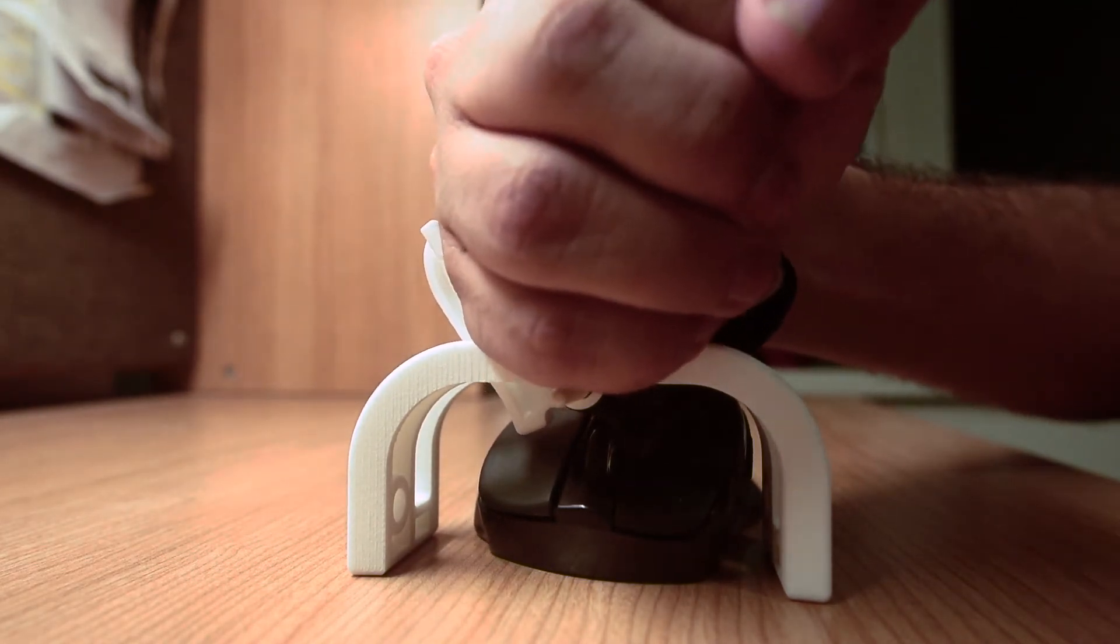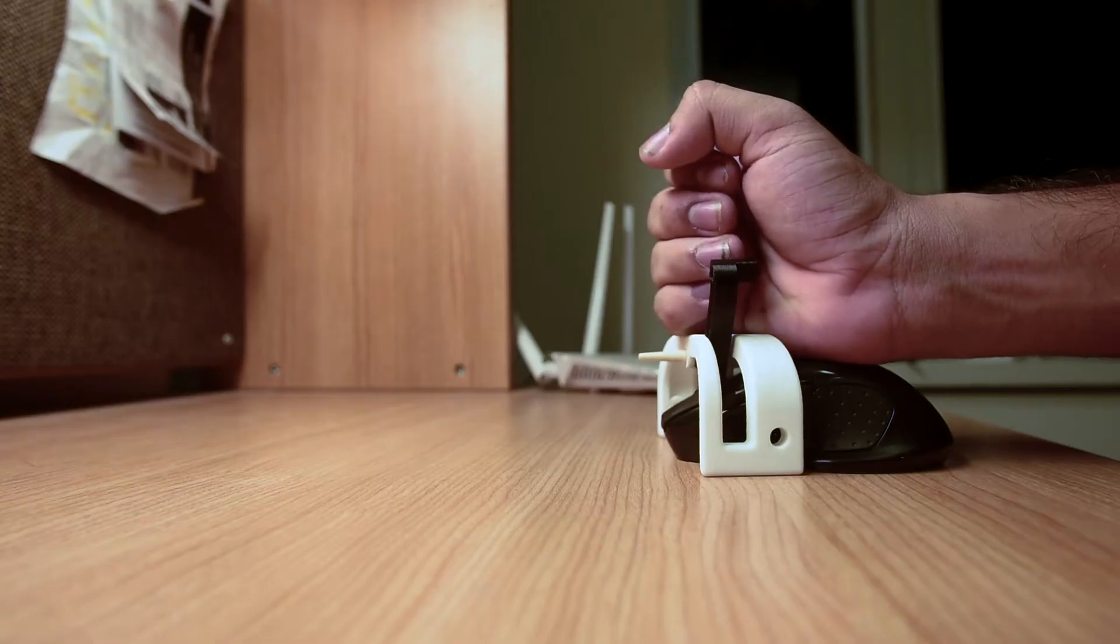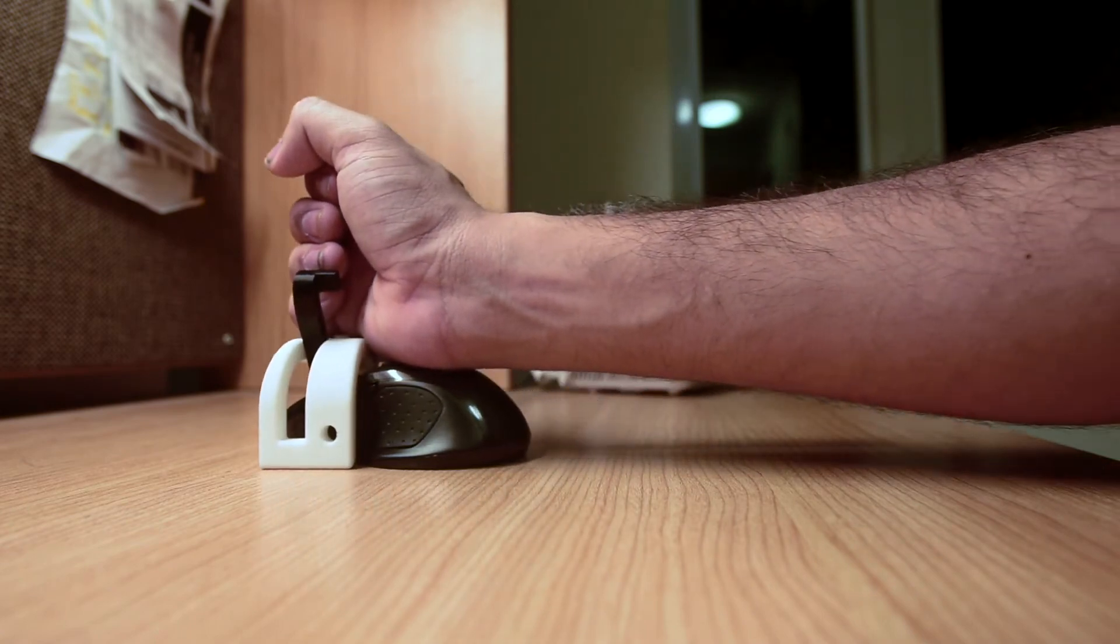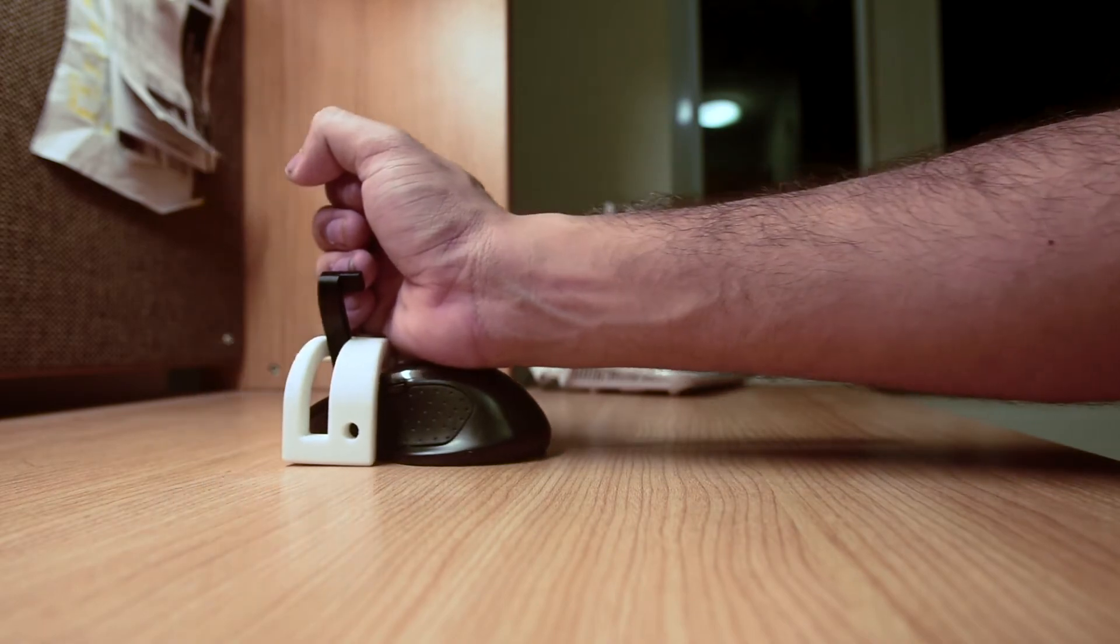One improvement that this device provides for Ken over his existing solution, a trackball, is that he is easily able to click and drag by tilting and moving his hand. This gives him the ability to interact with many types of software in ways he could not before.